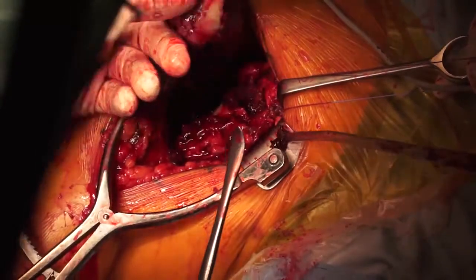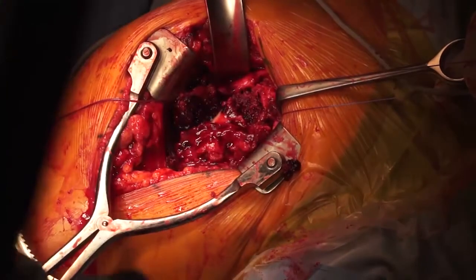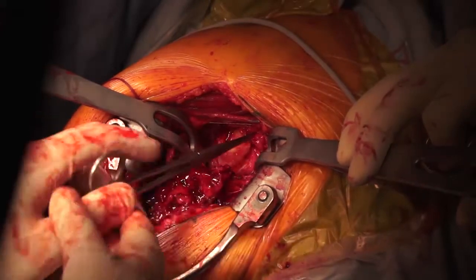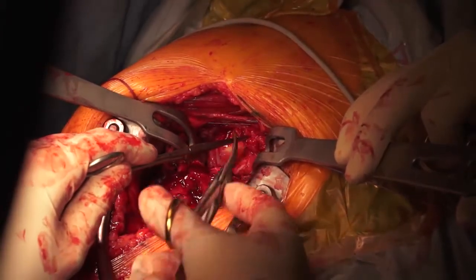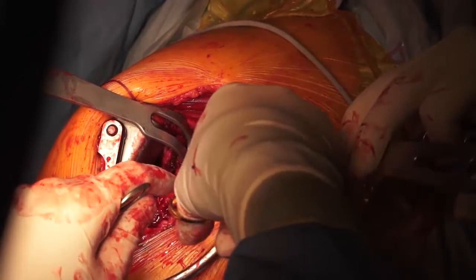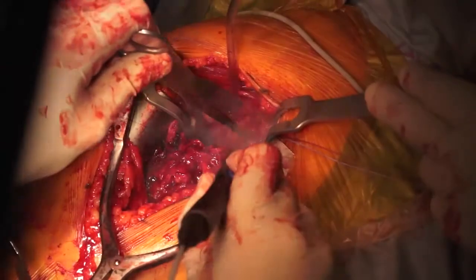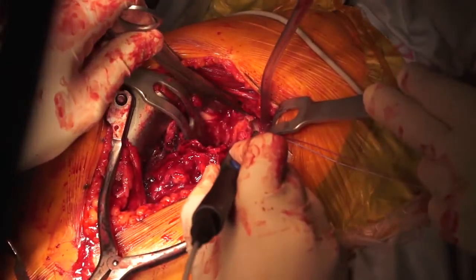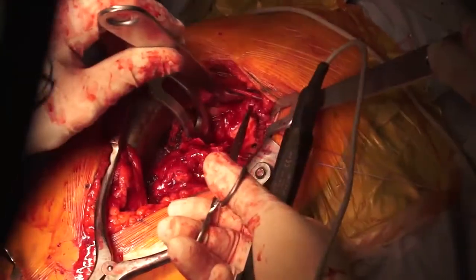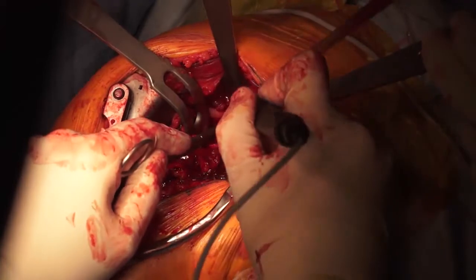The extent of the injury with existing osteoarthritis is visualized. For exposure of the glenoid, the humeral shaft is retracted dorsal and cut off. Excision of the supraspinatus tendon. After circumferential capsulotomy and excision of the labrum, the midline of the glenoid is marked with electrocautery.